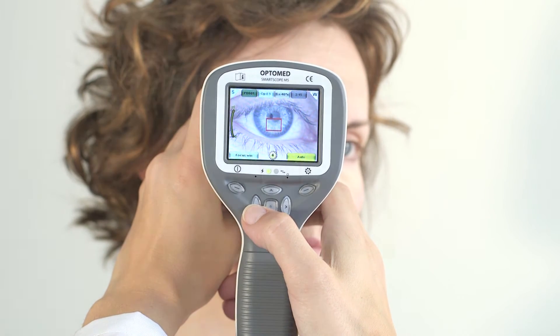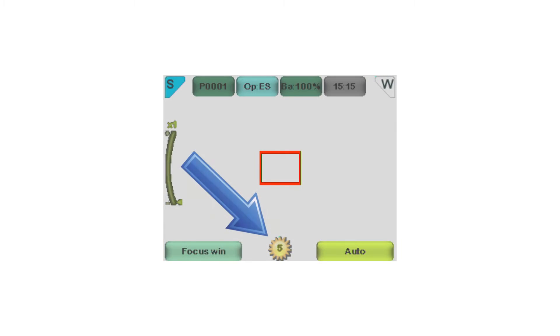Adjust illumination by using the left and right arrow keys. There are altogether ten brightness levels, with a default value of 5. Be careful not to overexpose the image.